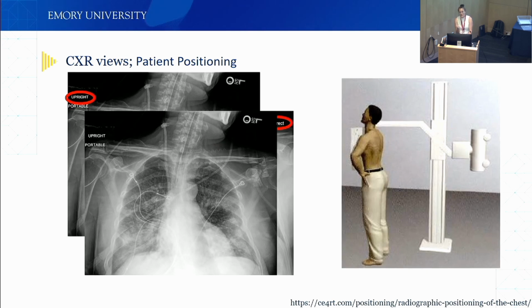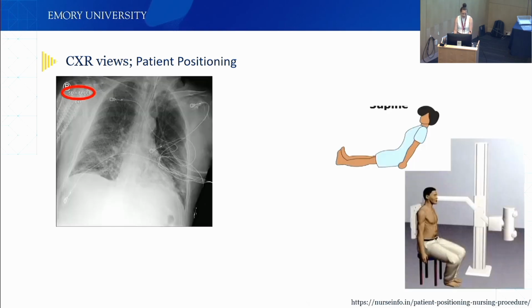If you have outliers in your accuracy, or if your heat map shows something weird, it's good to sometimes go over that. We sometimes make a slideshow of all of our wrongly predicted cases and just go over them if we see things like this.